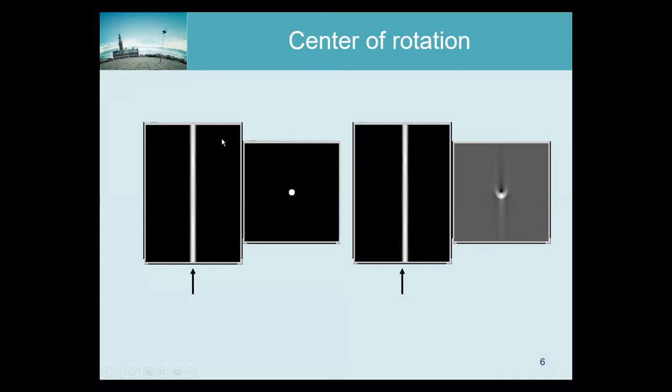So if I put a point source exactly in the middle, you would expect the sinogram to look like this. And the reason is that you assume that the center will project exactly in the middle of each sinogram row and therefore it would be the same. But in principle, it doesn't have to be like that because the position of the rotation axis is a mechanical thing. And where exactly that projects in your sinogram is a combination of the electronics, discretization and the software that actually puts it in the image. And they don't necessarily have to be synchronized. And as I just said, in some of the gamma cameras we have seen, that was definitely a weakness.